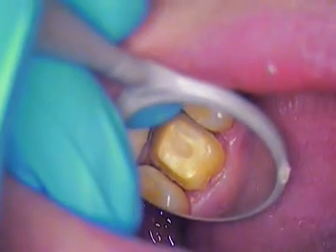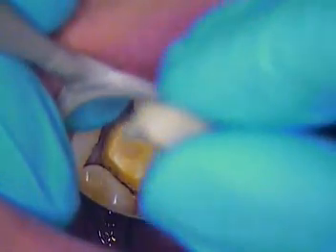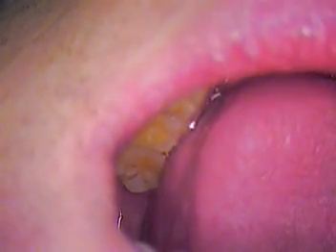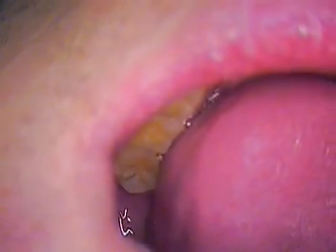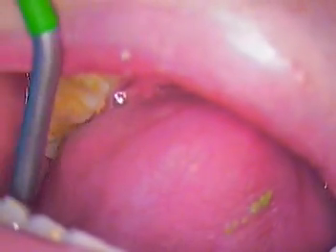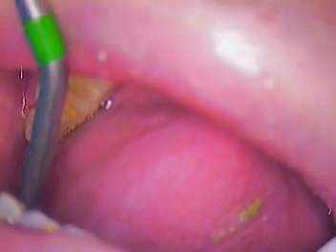Okay, so here we are. This is our provisional, our temporary treatment crown. That's going to go in like that. I'm going to mix. And this is the Dycal material. There it is. I'm going to mix it, load, and in it goes. That's good. He's dry. Mixing now. Out, please. Loading.